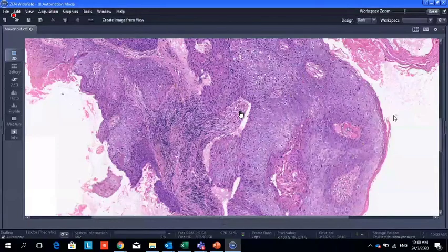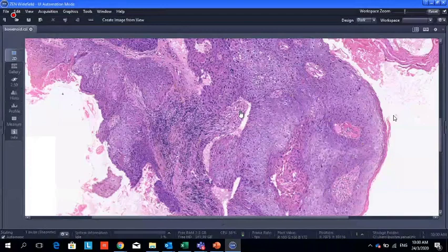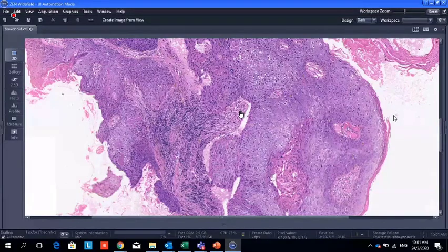Okay, I can move to the second case. The prognosis actually is good. We said good because there is no invasion. Some Bowen disease or Bowenoid papulosis, some of them disappear, some of them do not disappear. In this case, we have to do surgery.